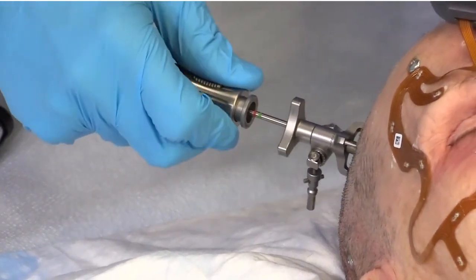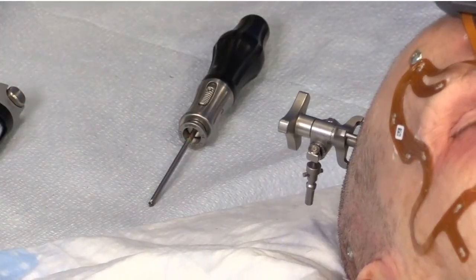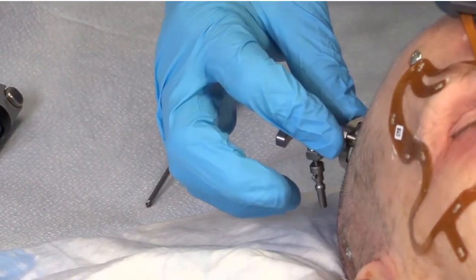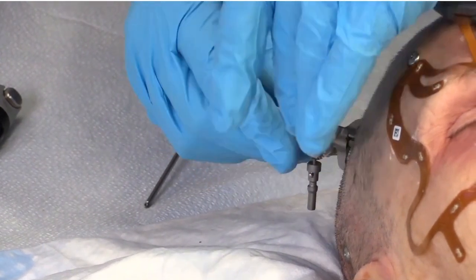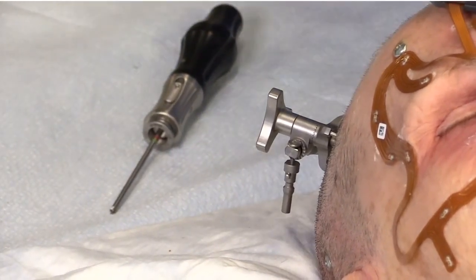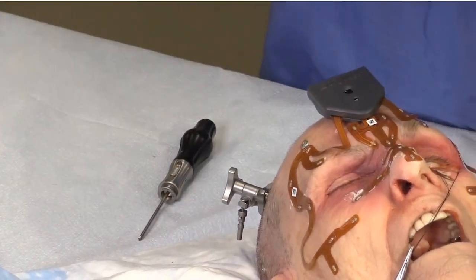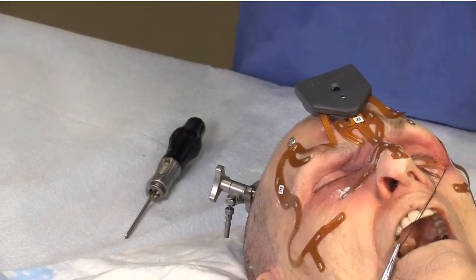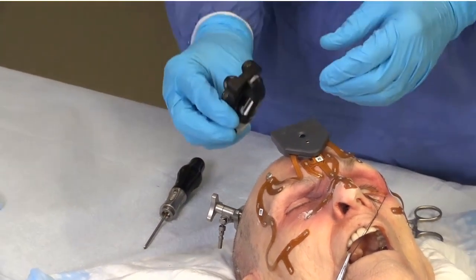That's only a single point of contact and it's not going to be very rigid — and you want this not to move during the case. The next part of the setup is that you've got three spikes, which get pushed down to the skull and fixed with this wheel here. In general, you're going to want this to be facing the eye, because these lights need to communicate. If you're blocking them or they can't see, it's not going to work.